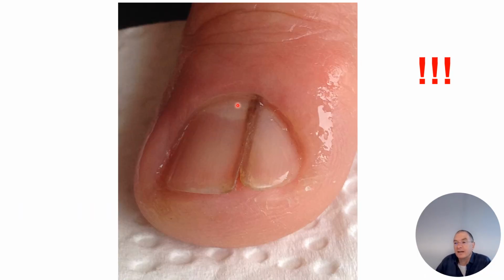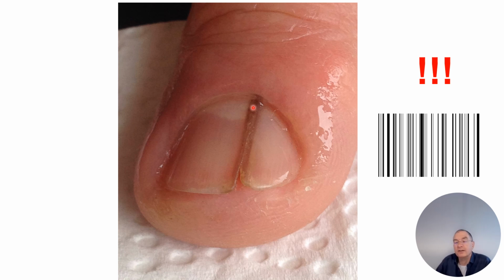In this case, I took this picture with my mobile because I did not have my dermoscope with me when I visited friends, and a good friend of ours showed me this lesion. Longitudinal, initial barcode, and have a look here, Hutchinson sign, older than 50 years and new.